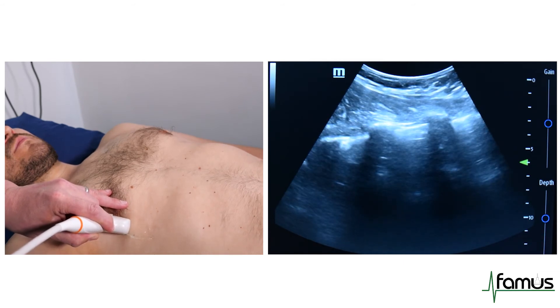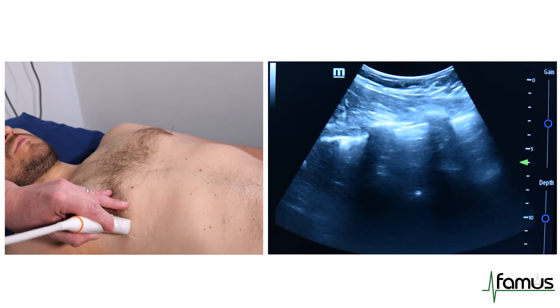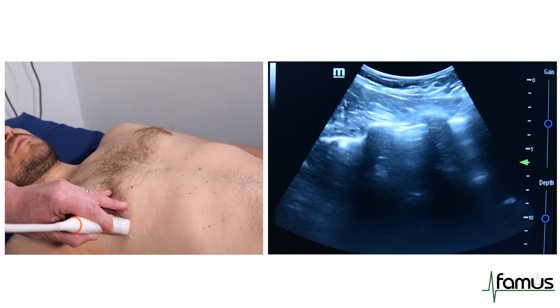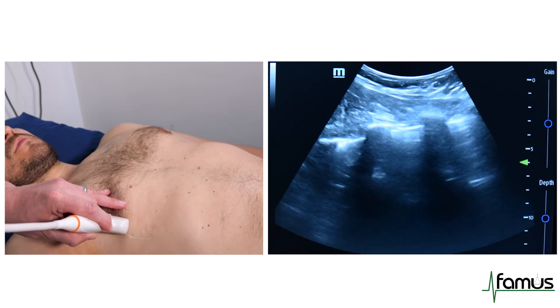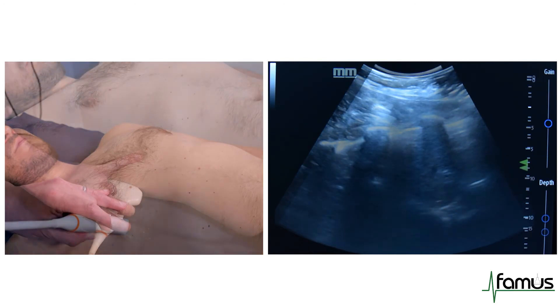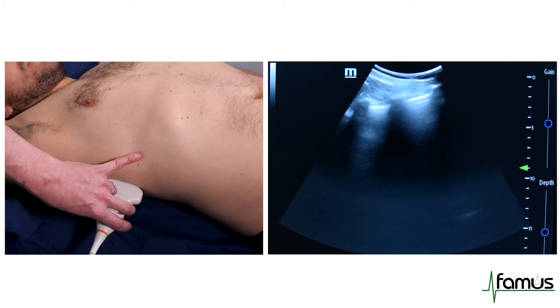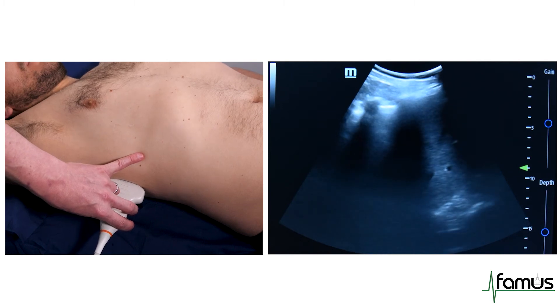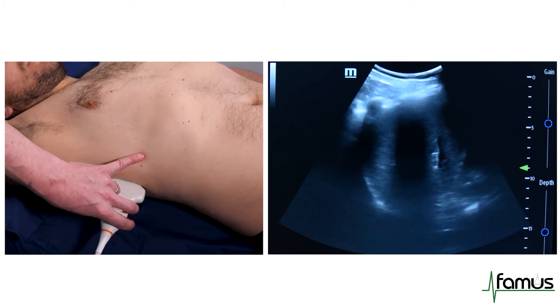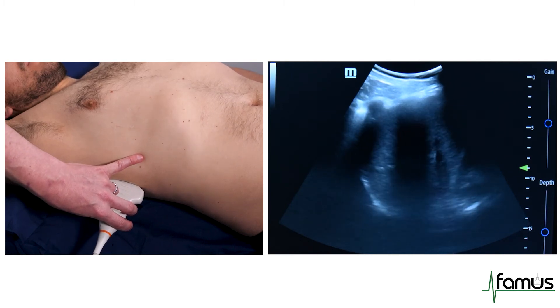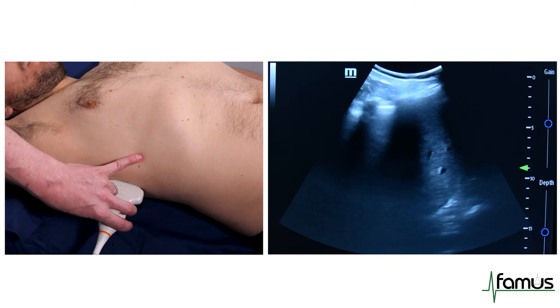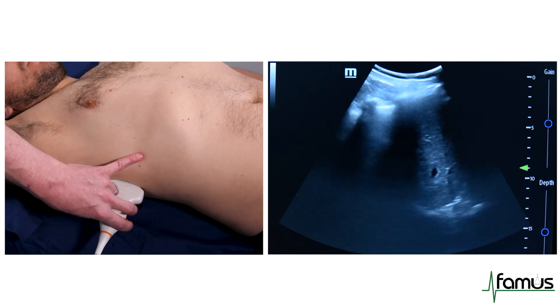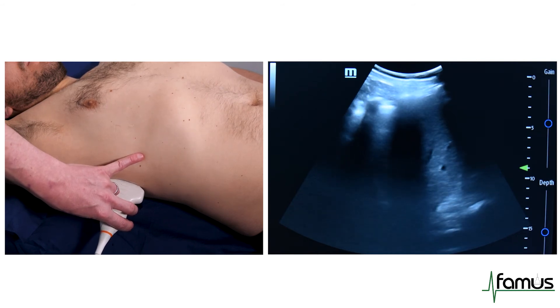We then move down to the lung bases for the final part of the thoracic examination. We keep the probe in the longitudinal position and we're looking for the posterior lateral point on the chest wall, which is highlighted here.